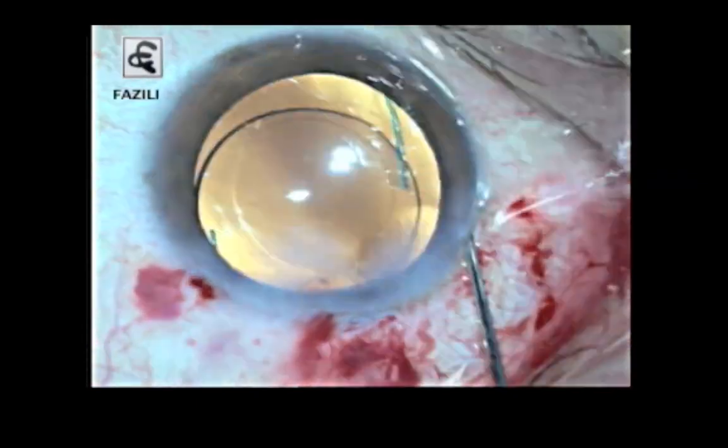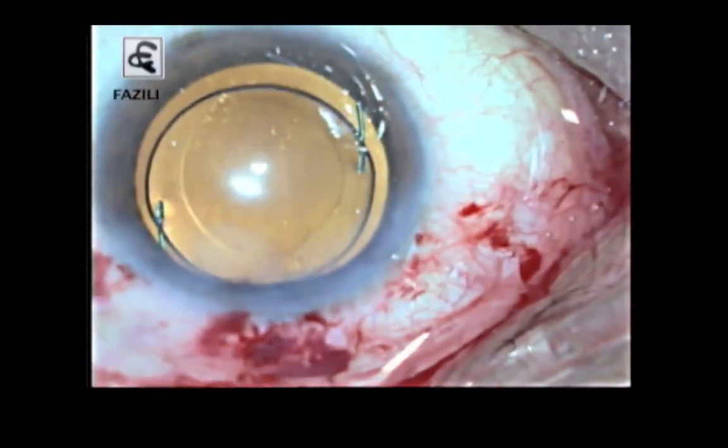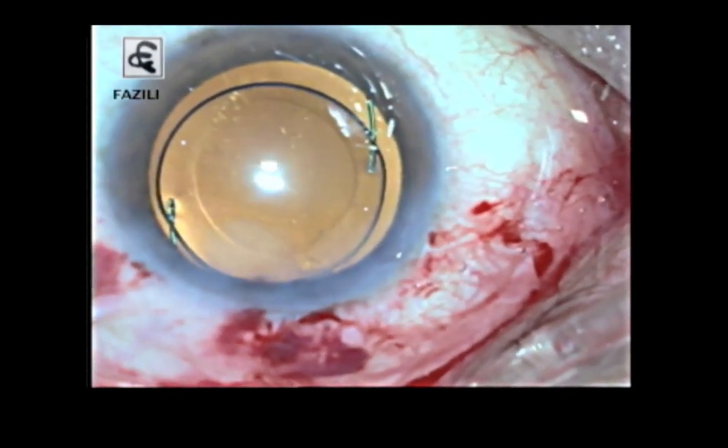It is never good for a myopic eye to be in a hypotonous state. Now you're seeing that the eye is absolutely taut and things have been done nicely.